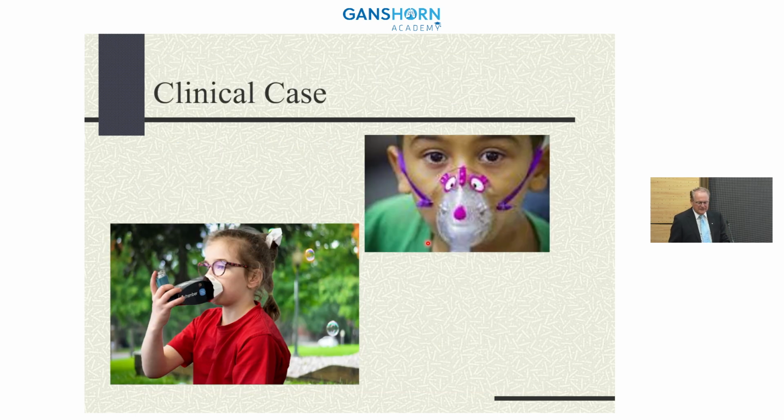So if we look at a given clinical case, and I'm not suggesting that oscillometry is limited to young individuals. I'm not suggesting that it's limited to individuals that have neuromuscular disease or the elderly, but certainly it's a methodology that lends itself to performing it on children, because sometimes children have difficulty in performing an acceptable and repeatable spirometry measurement.